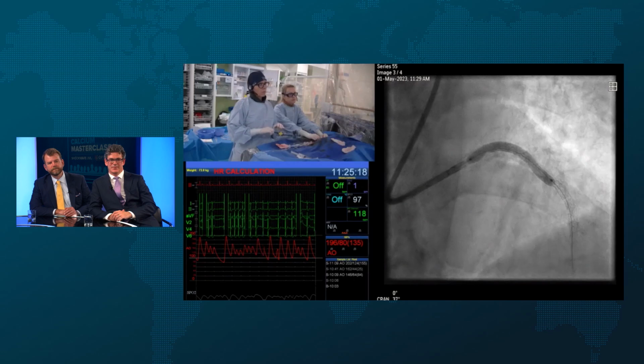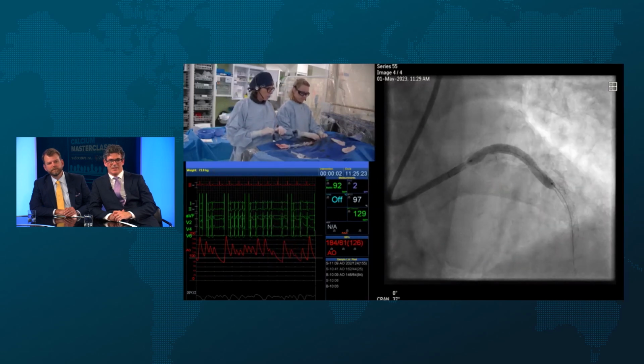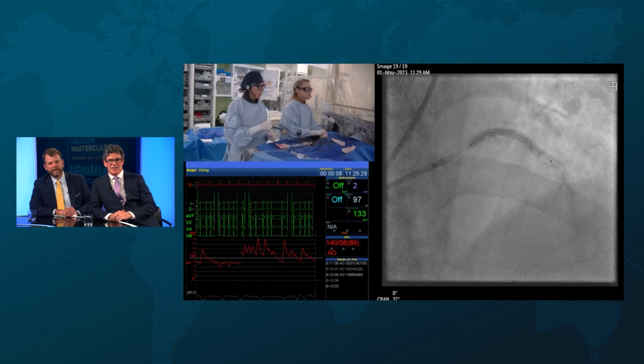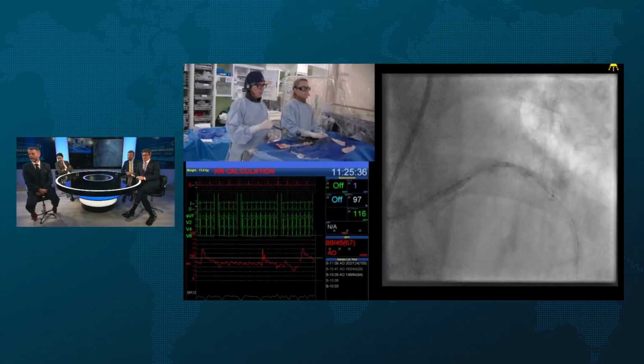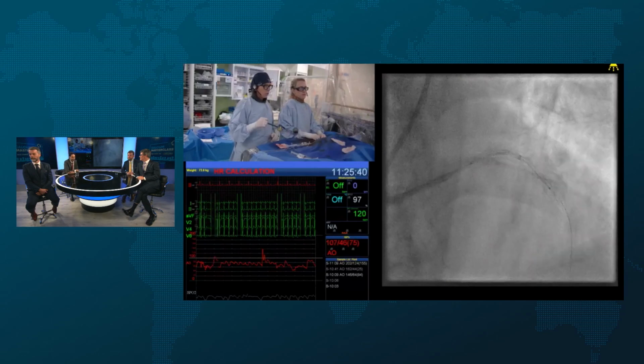Okay, so we're going to be very careful now with the front of that stent because it's floating. Put your guide extension in it and you'll be happy. You won't take your time with that. Track it very carefully over the balloon, deflating. There we go, nice. That's lovely. Okay. So we'll do the POT first.